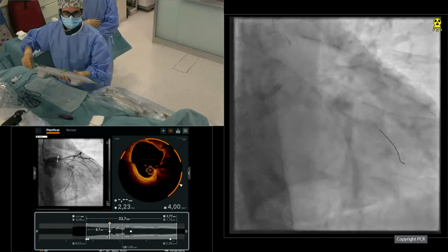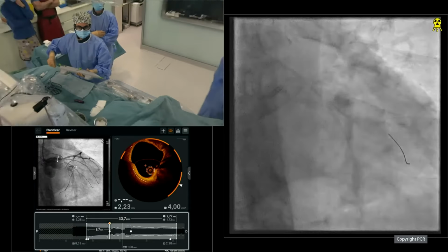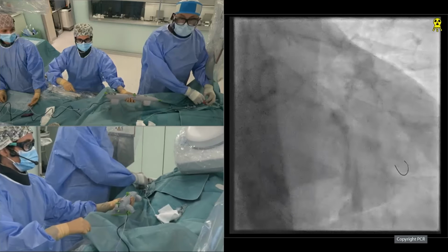I will be with you in a second, Emanuele. Okay, so you could stop. You could now put the glide assist to advance, but actually, what I do is if it is running well, I just do it like that. Stop it. Nieves is holding the wire very nicely, and of course you make sure there is no tension whatsoever. The wire is in a good location, by the way. We will pull it back a bit in a second. We tested before that it's in the right place.